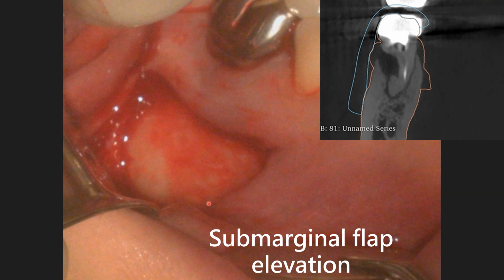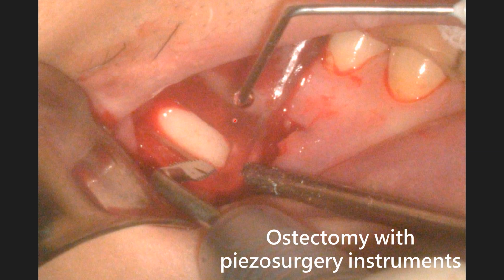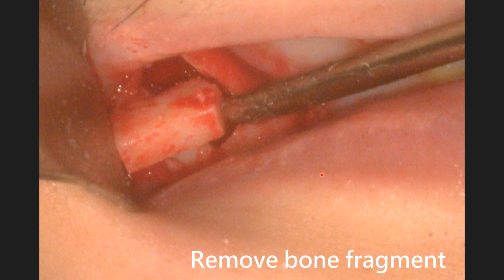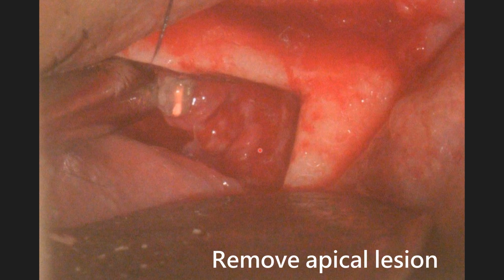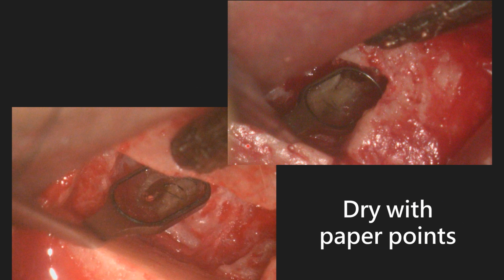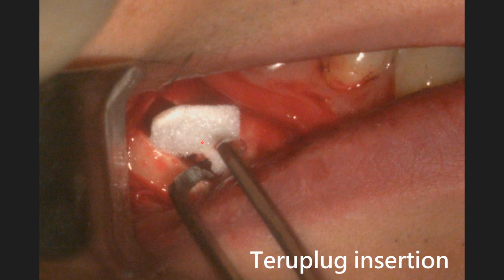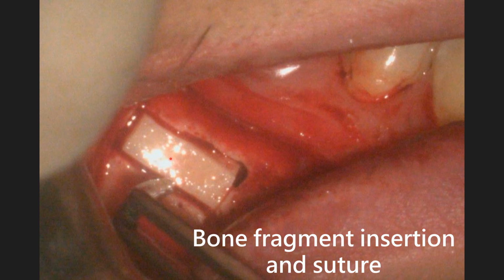So I reflect the flap, and I use this piezo surgery instrument, which is from Acteon, and I cut the bone plate, as you can see, and I remove the bone plate, and I do the root apical surgery, retrograde preparation, and retrograde filling, and I put a collagen plug and put the bone fragment back to the area and perform the suture.